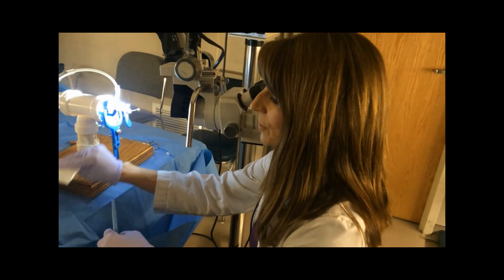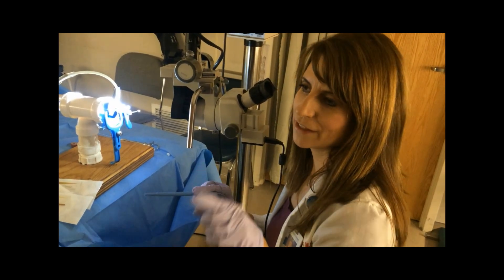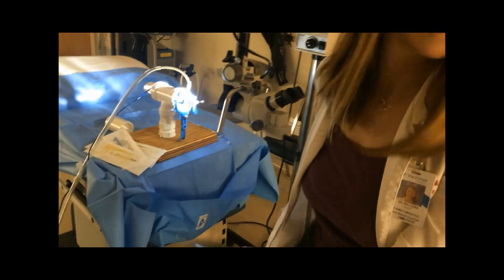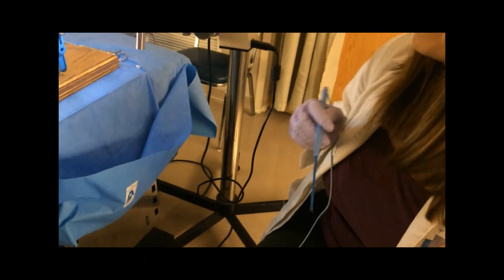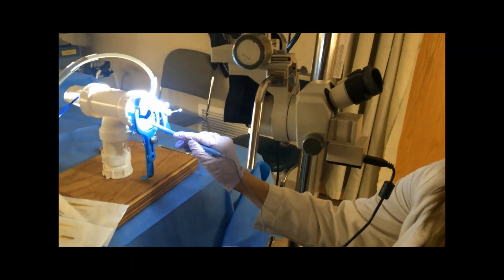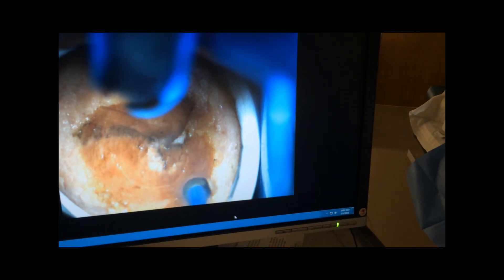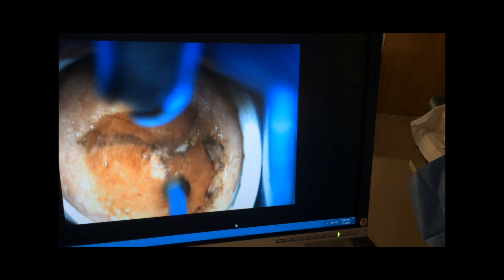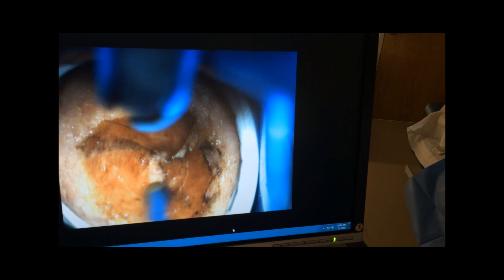The next thing I would do is take a ball electrode and do a full graze around the edges. I'm not going to actually demonstrate the full version because it makes so much smoke, but you basically just burn all the way around these edges, and then go a ball-width or two more internal, being very careful to avoid the os.